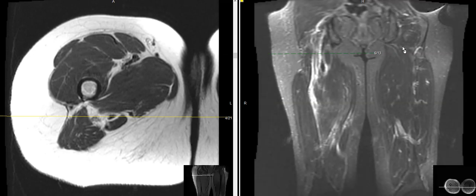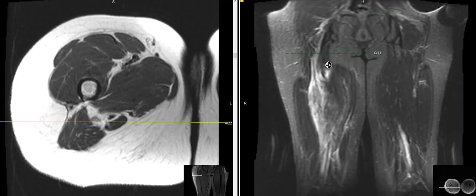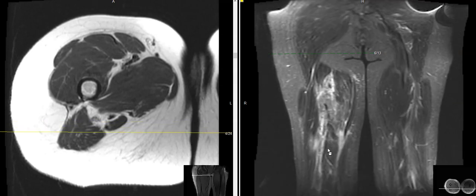So this is a coronal view. This is the left back of the thigh. These are the hamstring muscles in back. This is the right side that's abnormal. We can see that there's lots of brightness here, and this is a muscle tear.